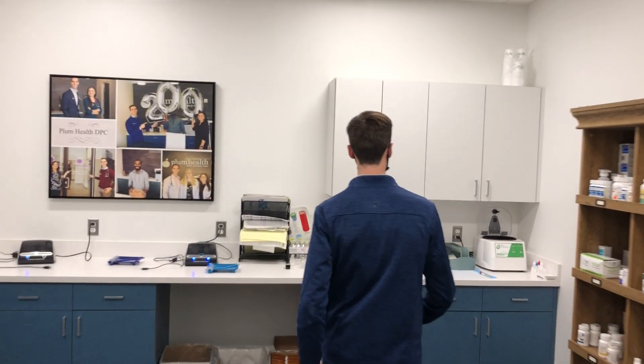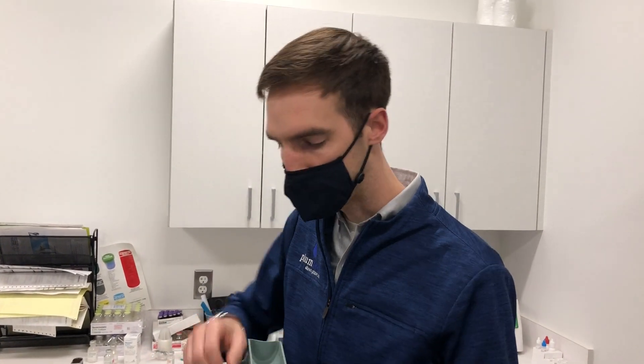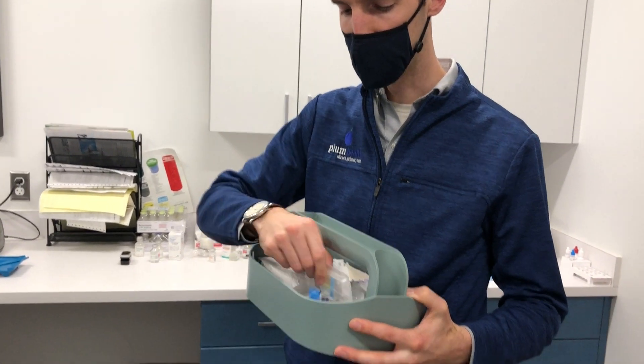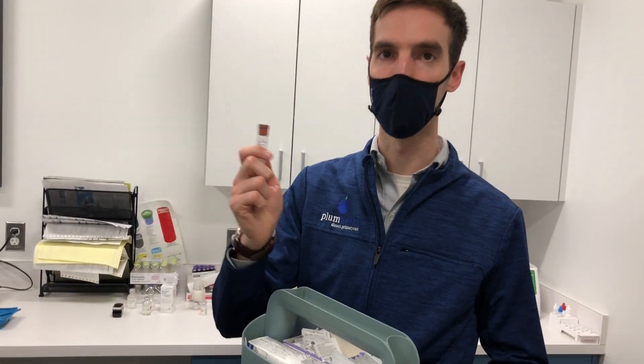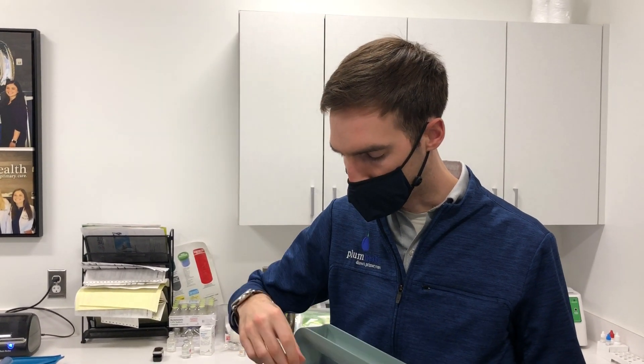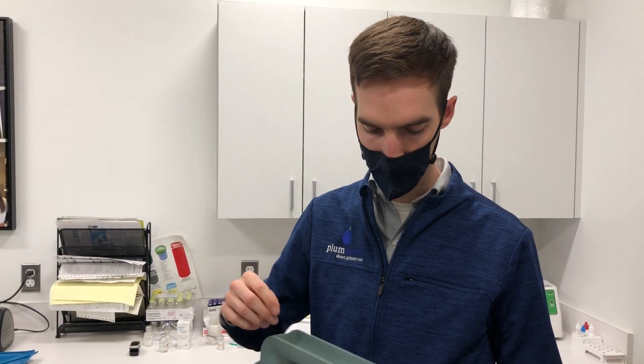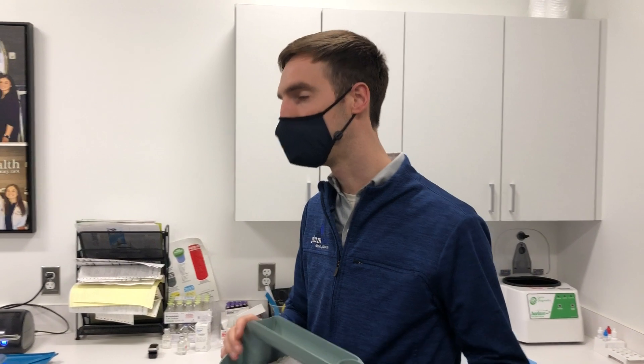Once we're in the laboratory, we use this little caddy that we bought. It's got our butterfly needles, it's also got our tiger top tube as well as our lavender top tube, and whatever tubes we need to use. We also have alcohol swabs, we have cotton, and we also have some bandages.